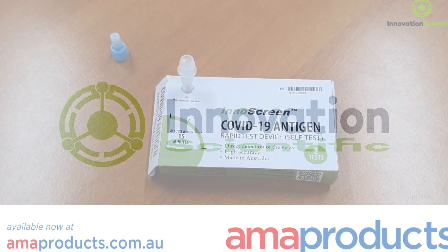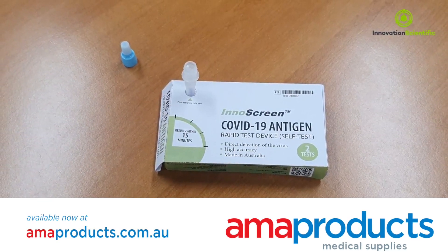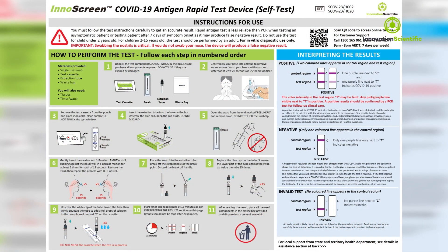You are watching a tutorial on how to perform the Innerscreen COVID-19 Antigen Rapid Self-Testing Device for the qualitative detection of SARS-CoV-2 viral nucleoprotein antigens in human nasal samples. Follow the test instructions carefully to get an accurate result.